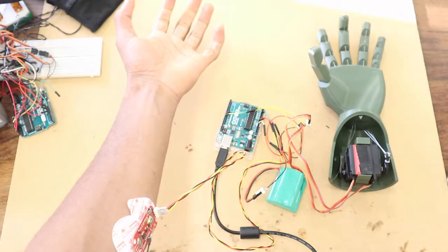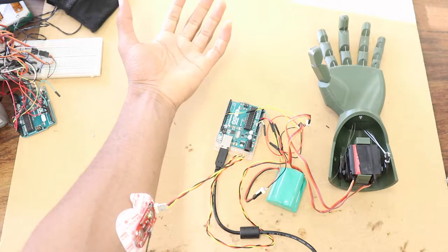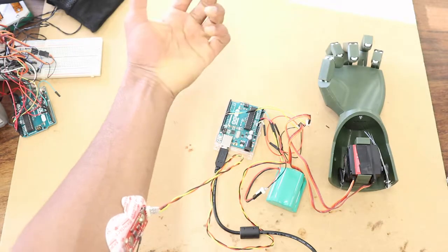The idea for this came from a project that we've been set, where changing input has to go through a control unit and then drive an output. As you can see, our hand uses a sensor that will attach to the arm and then be driven by a motor in order to clench the hand and thumb.